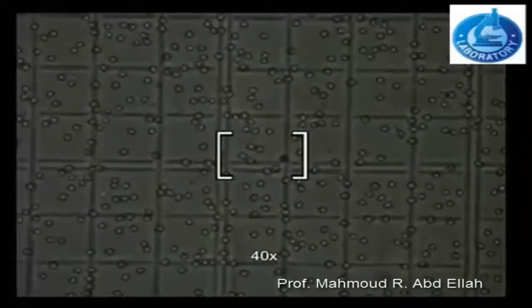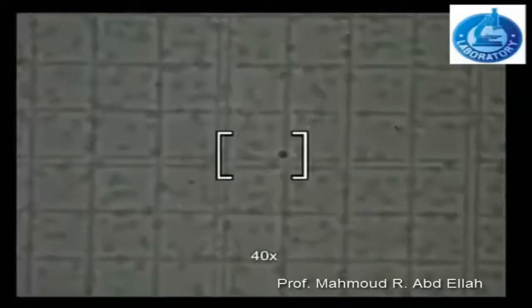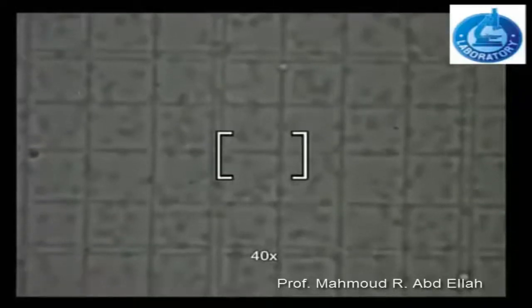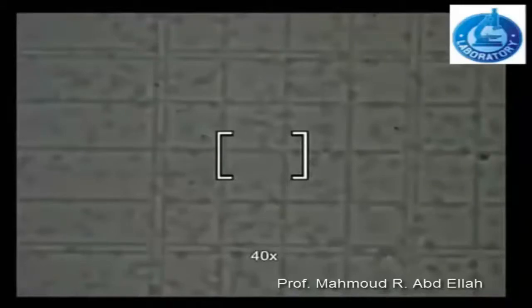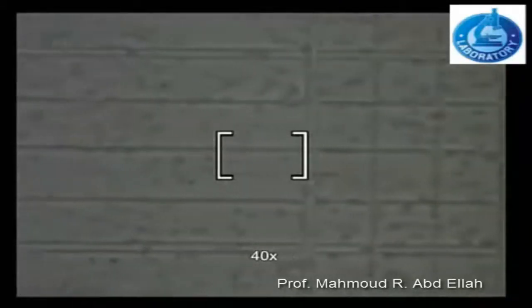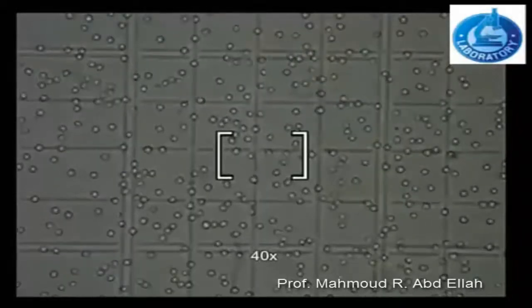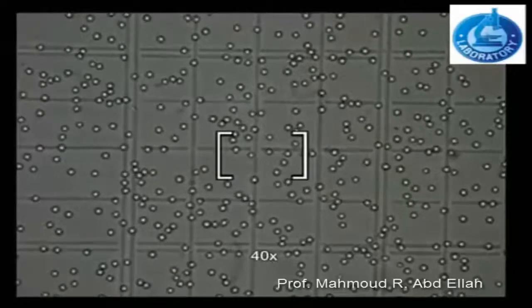At high power magnification, the red blood cells appear in the central area used for counting the red blood cells. The counting of the red blood cells will be done at the central area that contains the 25 squares, and only 5 squares will be selected.